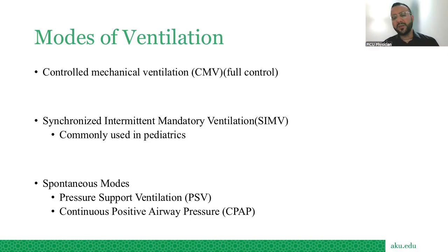One is controlled mechanical ventilation. In brackets, I've written full control. In this mode, by all the control I mean trigger, limit, and cycle. All of these are controlled by the mechanical ventilator. This is the fully controlled mode. The patient cannot do anything.